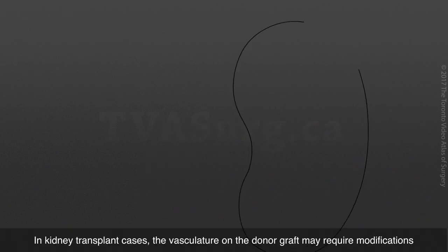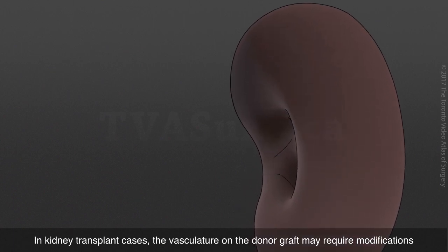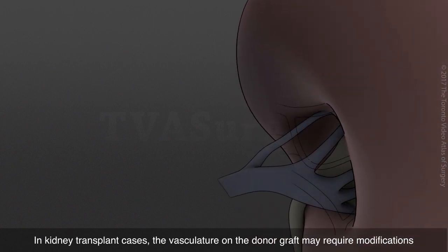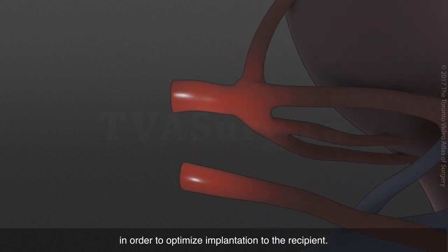In kidney transplant cases, the vasculature on the donor graft may require modifications in order to optimize implantation to the recipient.